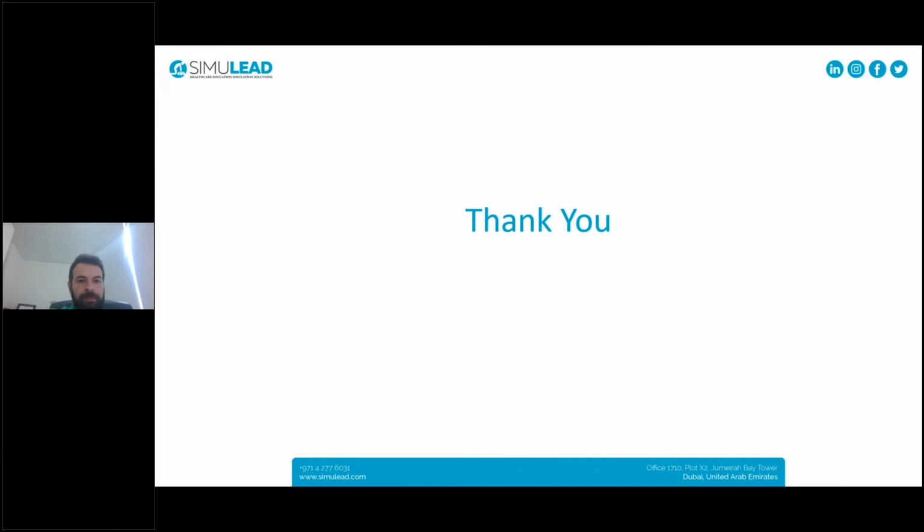Thank you, Ala. I wanted to ask one question regarding the post-processing for the cath. Can the end user manage the post-processing, do measurements, for example, do post-processing procedures, or only see and select some items?